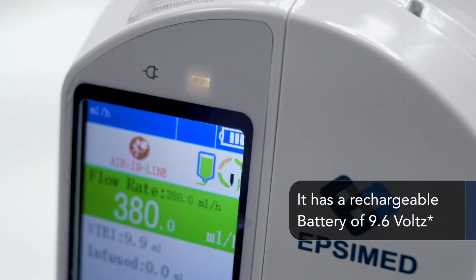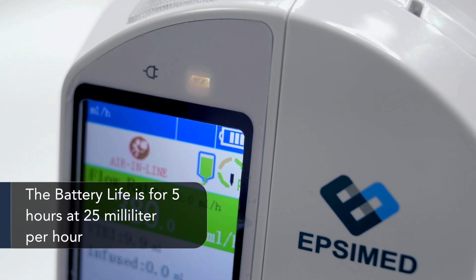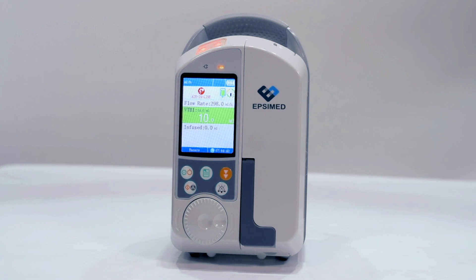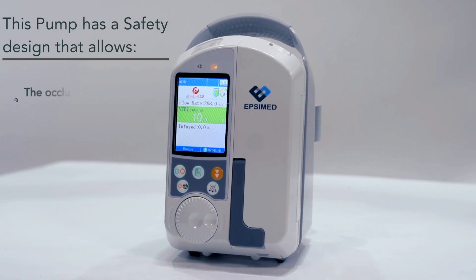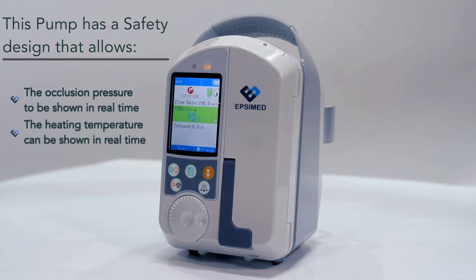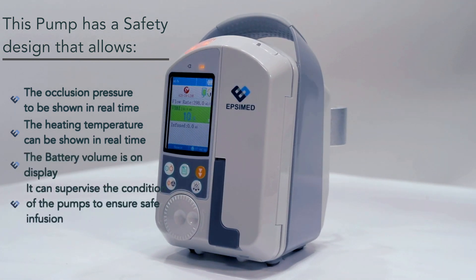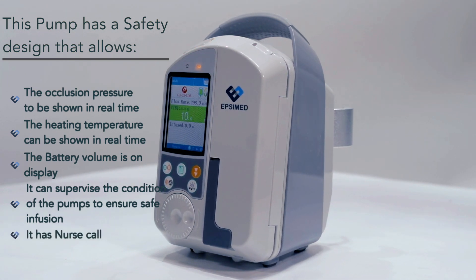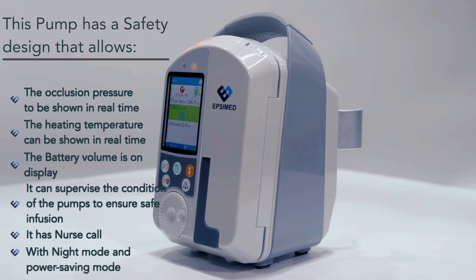It has a rechargeable battery of 9.6 volts with a battery life of five hours at 25 milliliters per hour. This pump has a safety design that allows occlusion pressure and heating temperature to be shown in real time, with battery volume on display. It can supervise the condition of the pump to ensure safe infusion, and features nurse call, night mode, and power saving mode.